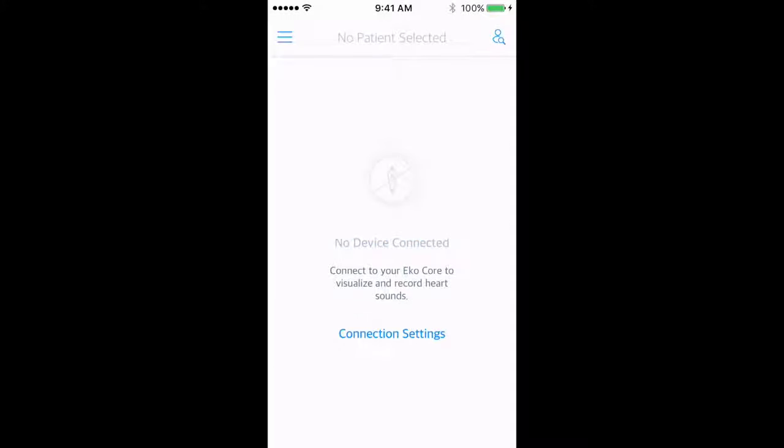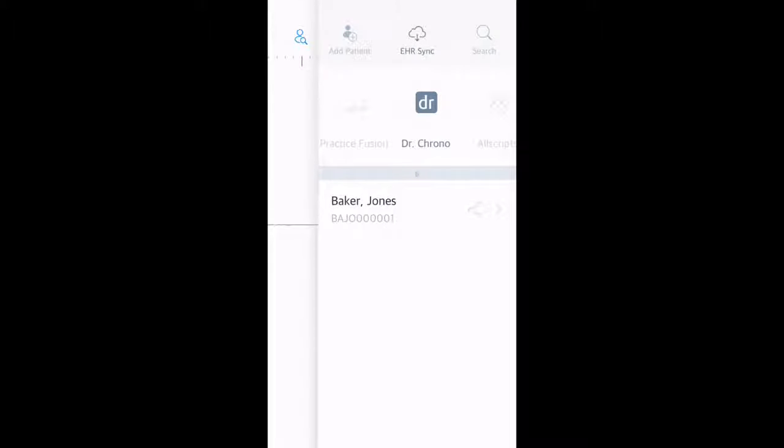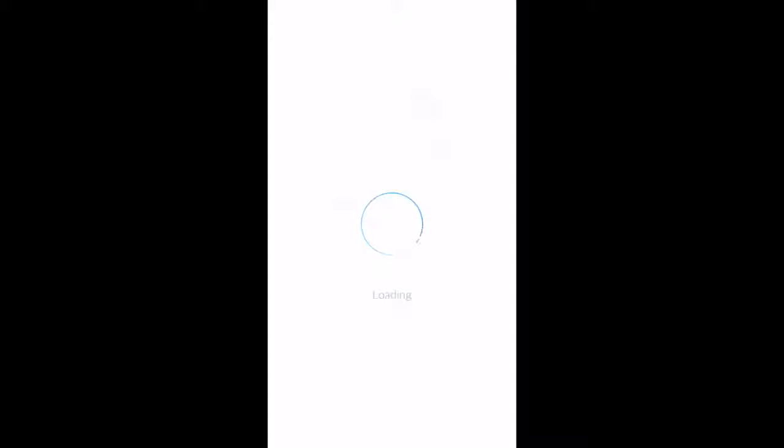In your ECHO mobile application, press the button in the upper right-hand corner to access your patient panel. Select EHR Sync, followed by Dr. Chrono.